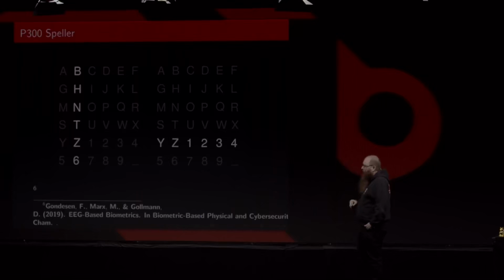Yeah. I haven't heard about the application on terrorism, but very similar, the application on criminal investigations as a lie detector based on P300. So basically the same. You are showing some pictures that only the guilty person knows, in guilty knowledge tests. But there are also some papers about how to prevent being detected if you are attacked by this P300 based guilty knowledge test.